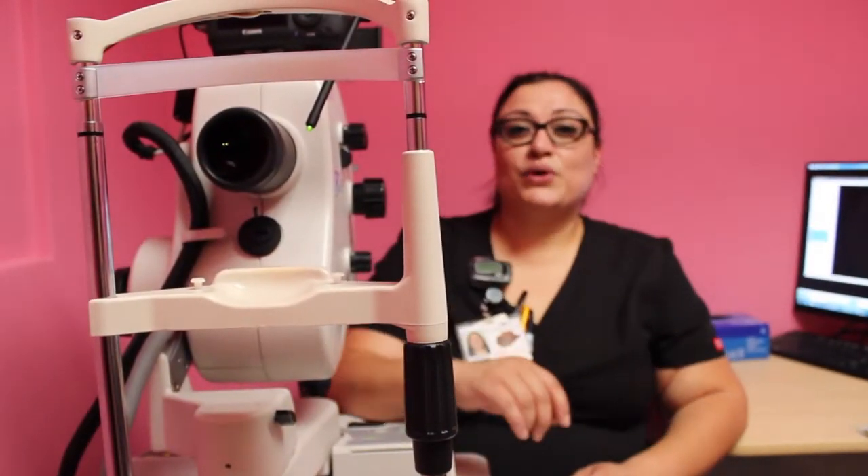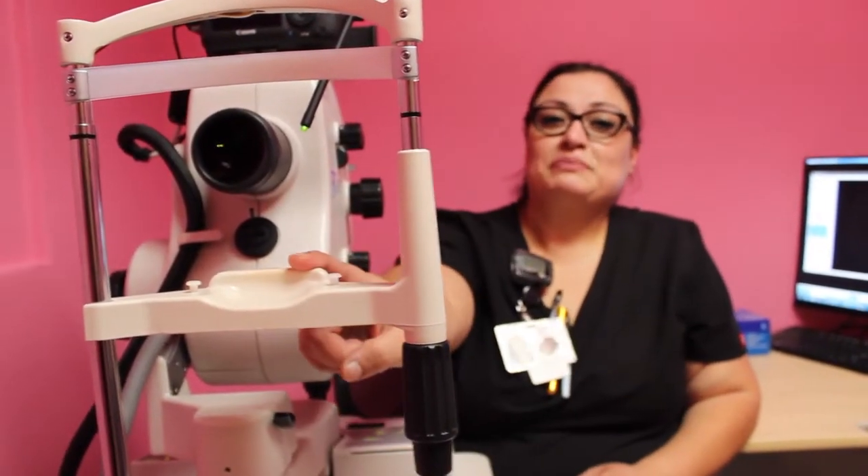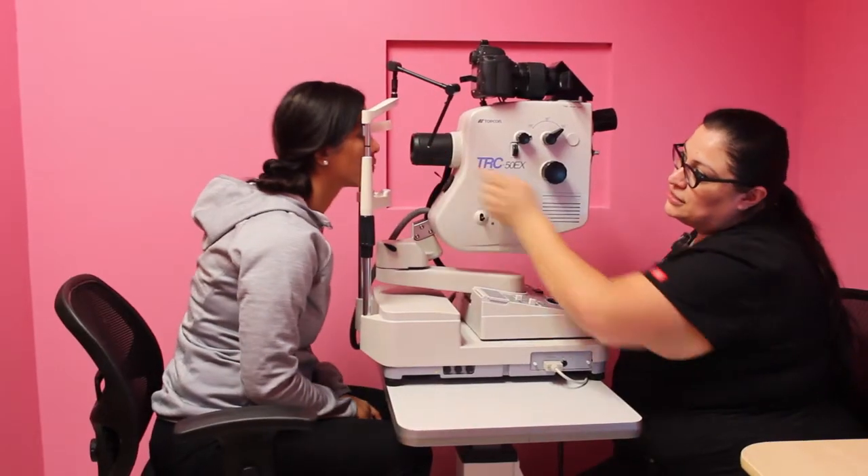Now that we have injected the dye, we're going to take some pictures. Go ahead and place your chin on the chin rest, forehead forward. Focus on this dot for me.